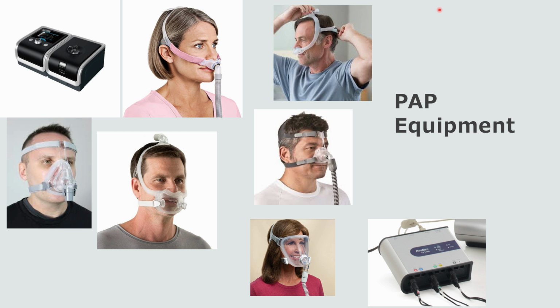If there is ever a problem with the TX Link, like it's not being recognized by the computer or you can't connect the computer to the CPAP, a lot of times it's because one of these wires is not plugged in all the way. Make sure they all click in, and make sure all the wires from the CPAP and into the TX Link are plugged in well.